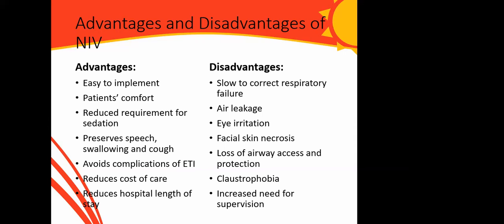The disadvantages include that non-invasive ventilation may sometimes be slow to correct respiratory failure. It takes time. And there are occasions of excessive air leakage, eye irritation, and facial skin necrosis. If we are not careful, if we are not vigilant, there could be a loss of airway access and protection.